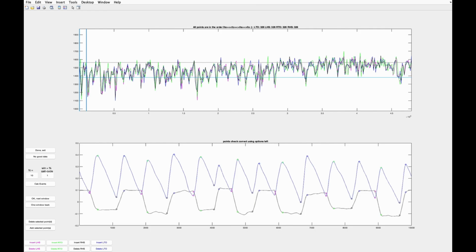For instance, in the current scenario, both conditions are satisfied. The events are correctly ordered, and each event has occurred an equal number of times, 326 times, resulting in a smile. To save these trial events, simply click the Done Exit button.